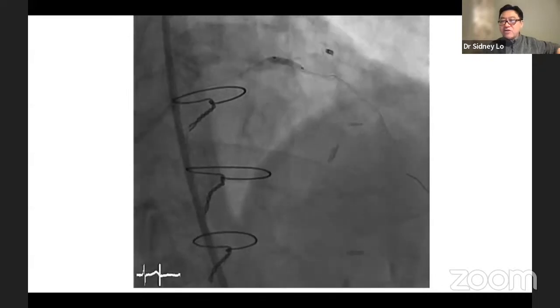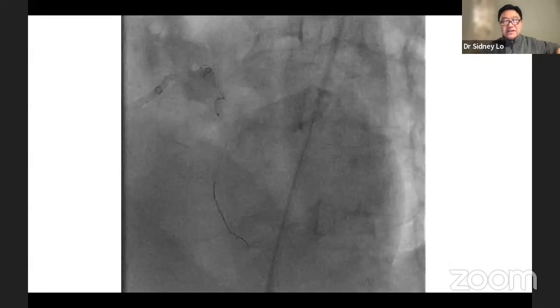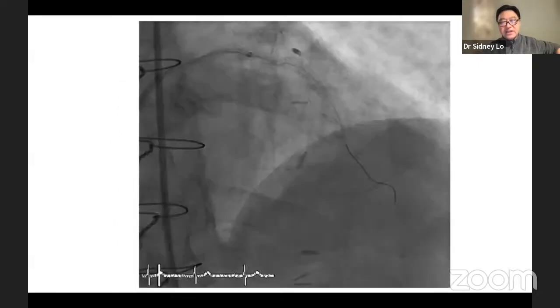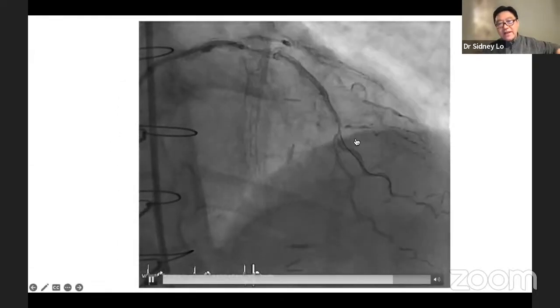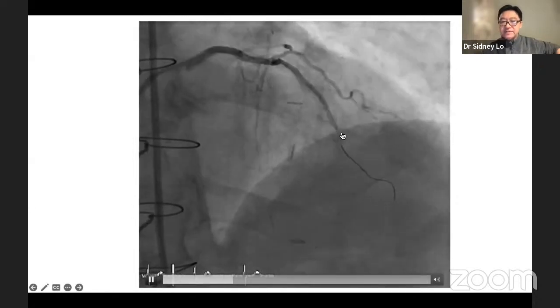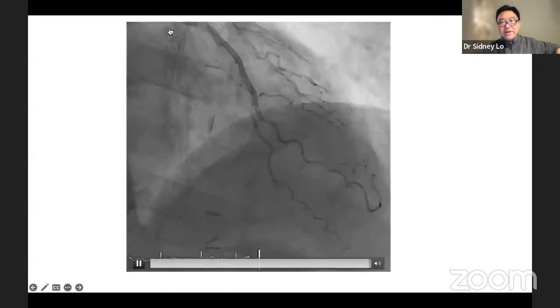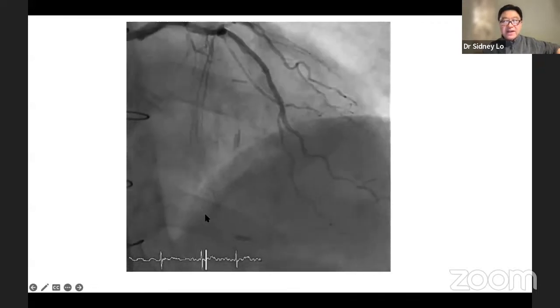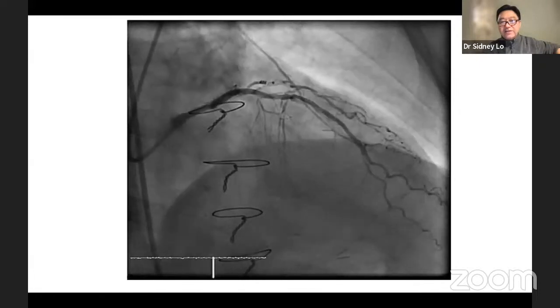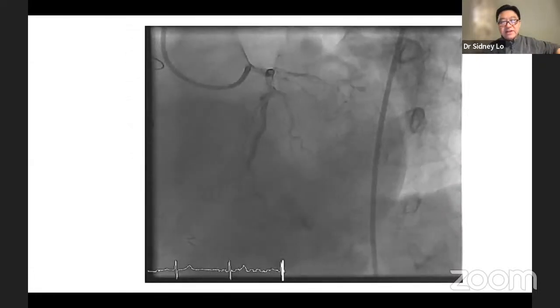This is an NSE scoring balloon, leopard crawled, guide extension, left main was stented, stents were passed through tortuosity. And we found a reason why the LAD failed, because you can see the LIMA filling at a site of a stenosis that's calcified. That was stented. And you can see clearly the LIMA going to the left-hand side to about 11 o'clock. And he did very well with stenting at his age. That's the result in the LAO.